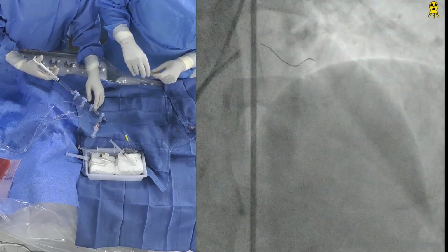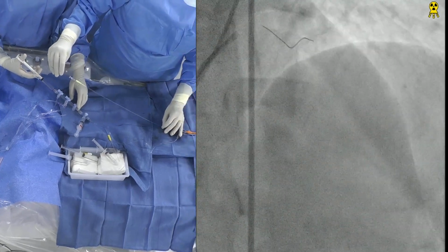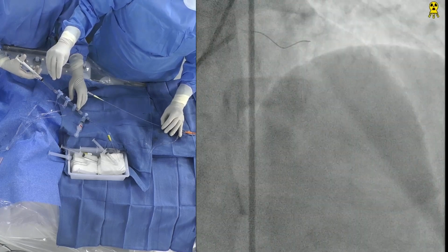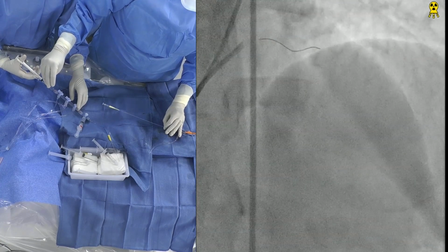Now, calcium at the lesion, you can see there, the wire is going into the diagonal. It is in the head. That's D1. What I'll do is get the Fine Cross till there, and then see if I can change it.